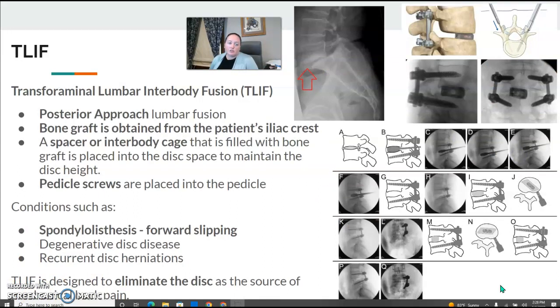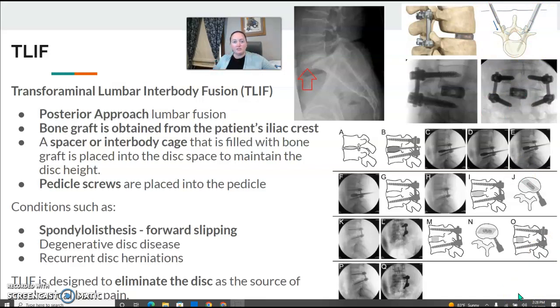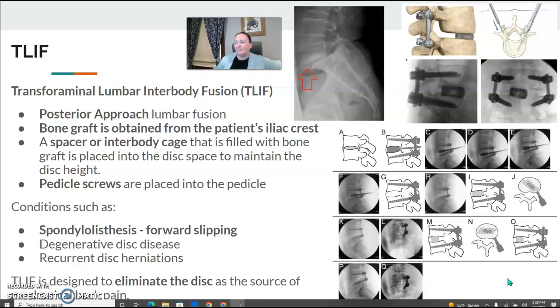The T-LIF — transforaminal lumbar interbody fusion — is a posterior approach to the lumbar spine. A bone graft is taken from the patient's iliac crest, and a spacer and interbody cage filled with that bone graft are used to maintain disc height. Then pedicle screws are placed into the pedicles. This is helpful for spondylolisthesis, that forward slipping, or degenerative disc disease or recurrent herniations. The goal is to eliminate the disc as the source of pain. This one involves pedicle screws, which makes AP and lateral imaging a bit difficult.